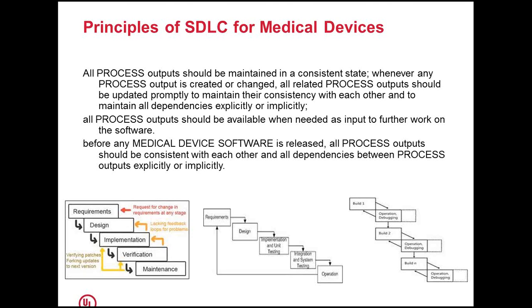It also talks about medical device software release. Before it is released, meaning before it is put in use, all the outputs should be consistent with each other, and all dependencies between the process outputs, explicit or implicit, have to be verified and ascertained as meeting the requirements before release.